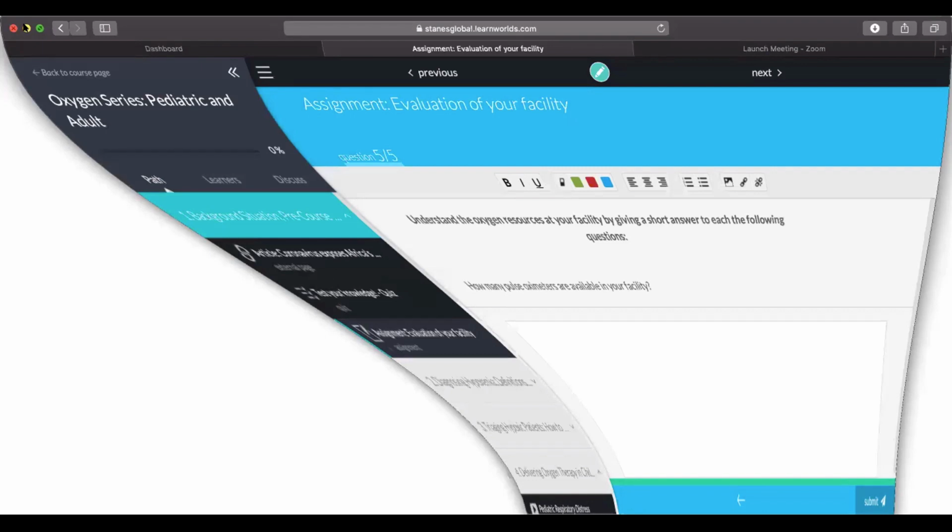And so this is a photograph or a drawing of the nasal cannula itself and how it fits on the patient. So the nasal prongs go into each nare on the patient, and then the straps go behind the ears. There's usually a tightening device that you can slide up under the chin, and that will hold the nasal cannula on the patient. So that is this portion of the drawing here. The other side of the tubing is usually quite long so that it can fit to the wall. And so you would plug this side into your oxygen supply.